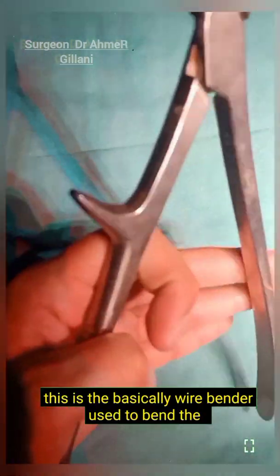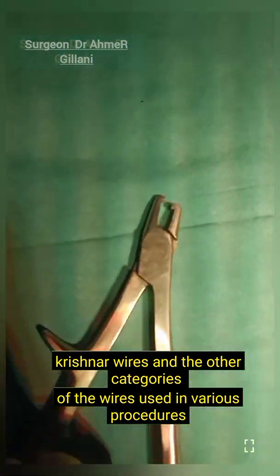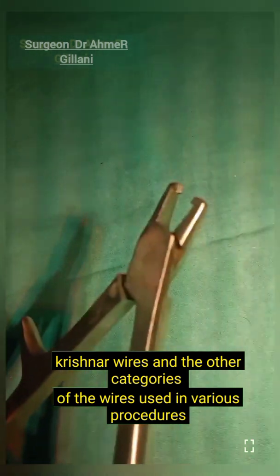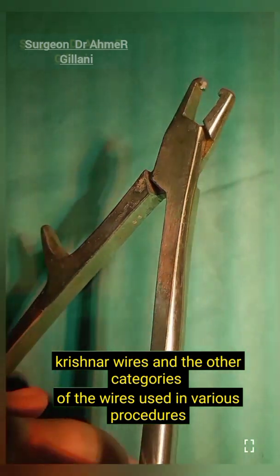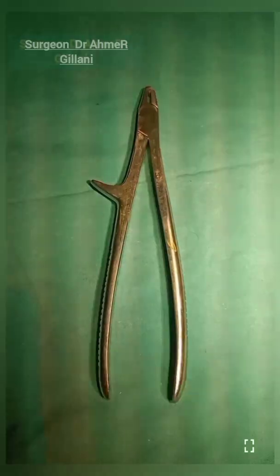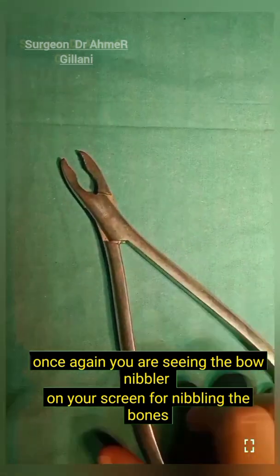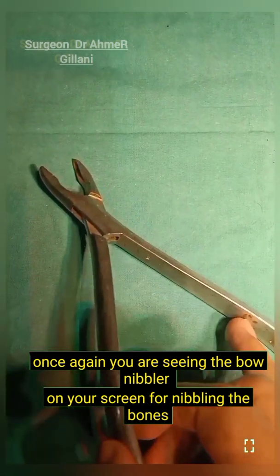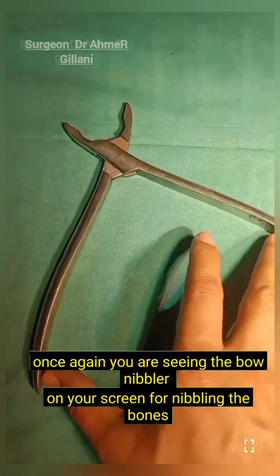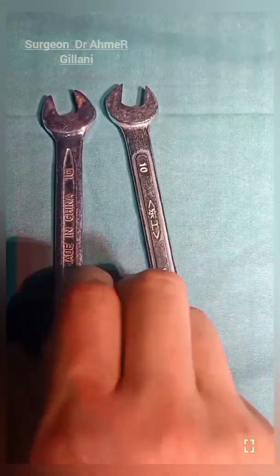This is the wire bender, used to bend Kirschner wires and other categories of wires used in various procedures. Once again you are seeing the bone nibbler on your screen, for nibbling the bones. This is basically the key which is used to tighten the screws.